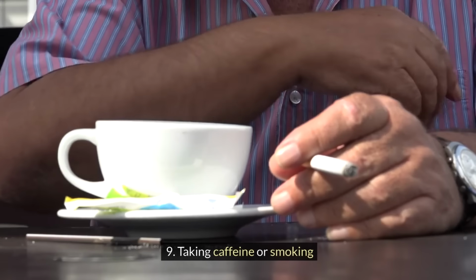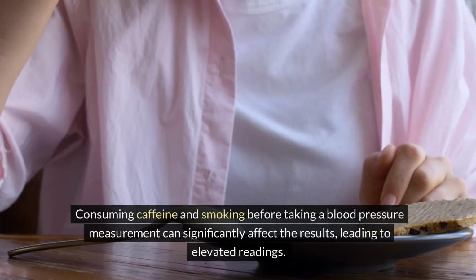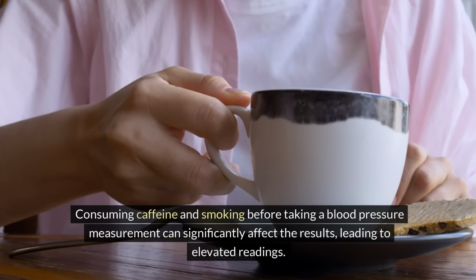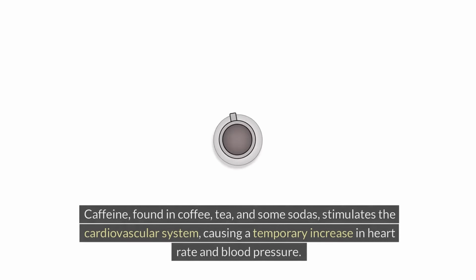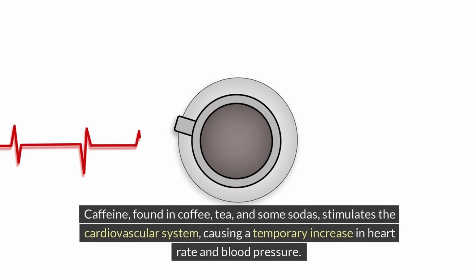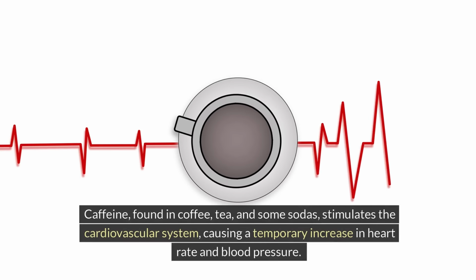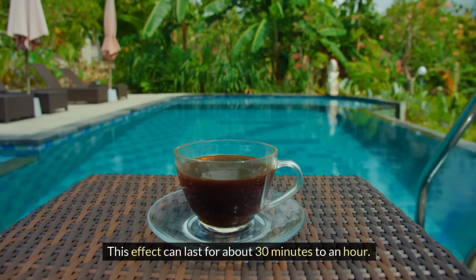9. Taking caffeine or smoking. Consuming caffeine and smoking before taking a blood pressure measurement can significantly affect the results, leading to elevated readings. Caffeine, found in coffee, tea, and some sodas, stimulates the cardiovascular system, causing a temporary increase in heart rate and blood pressure. This effect can last for about 30 minutes to an hour.